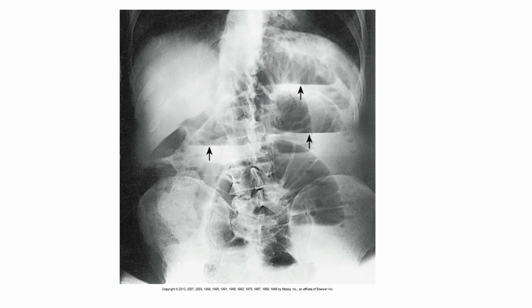Now, it is not nice to confuse your radiologist. You should always label your upright projections upright, either with an arrow next to your marker or the word upright typed in next to your marker. Okay? So that it's crystal clear to the radiologist. They will know, but they appreciate you clarifying that this is the upright projection.